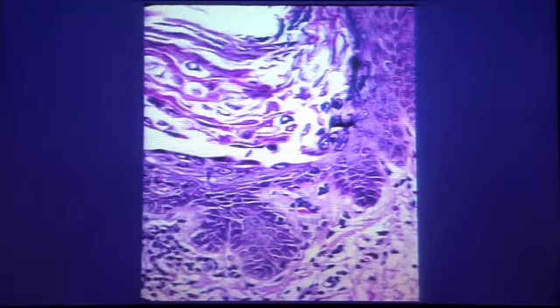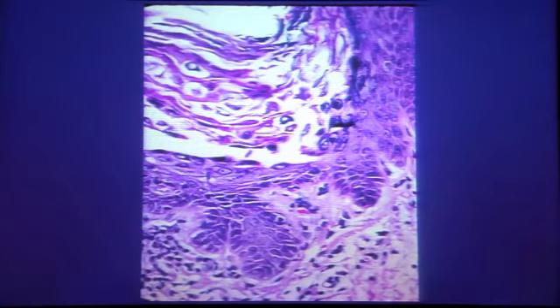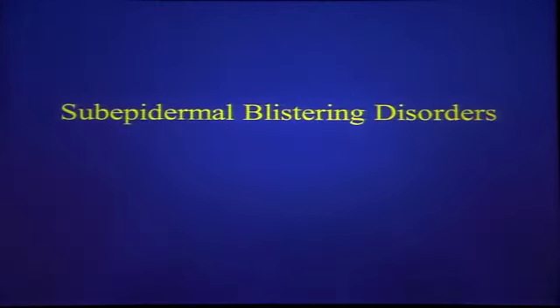And then a biopsy is done, and it shows changes that usually look pretty much like those that I just showed you with Darier's disease, focal acantholytic dyskeratosis. And in this case, there's no involvement of hair follicles, which helps you to make the diagnosis. If you see more than one pattern, if you see this in one area and superficial pemphigus in another area, that also favors Grover's over one of the other diseases.